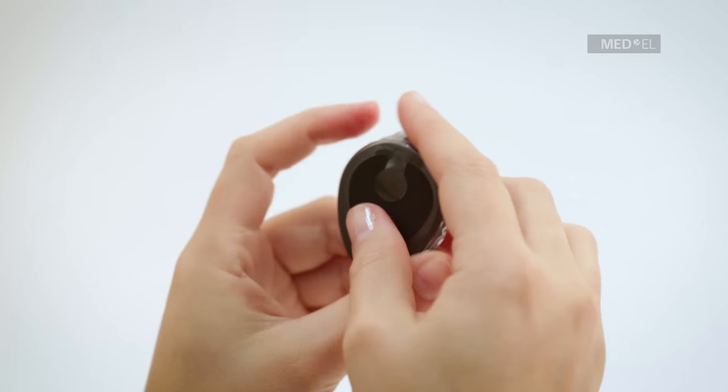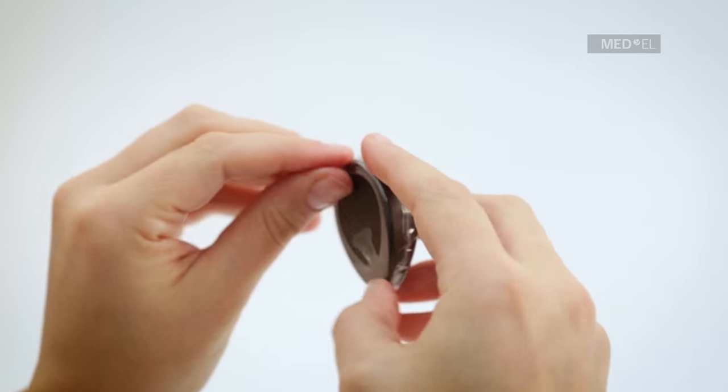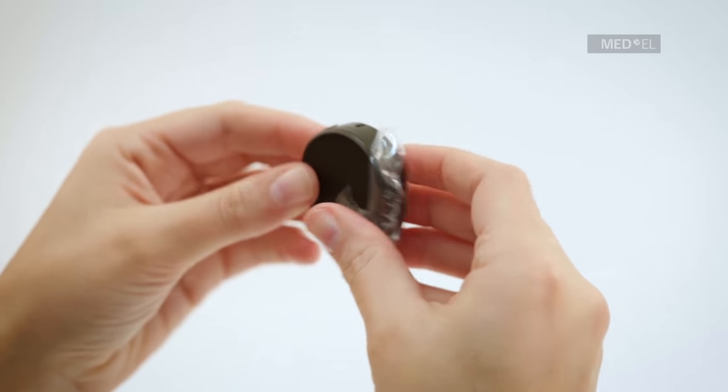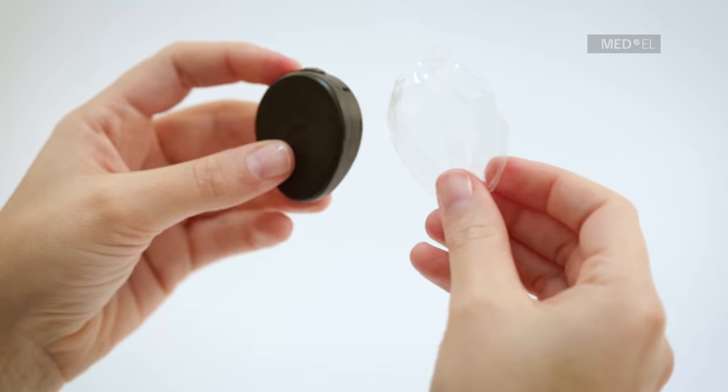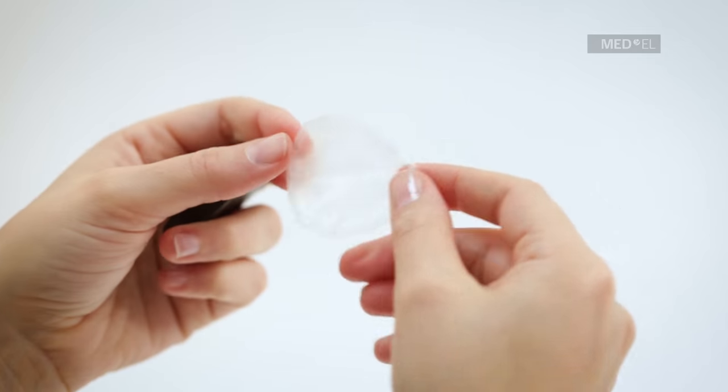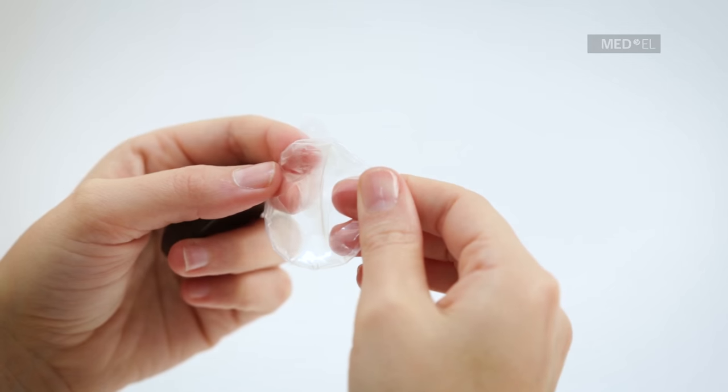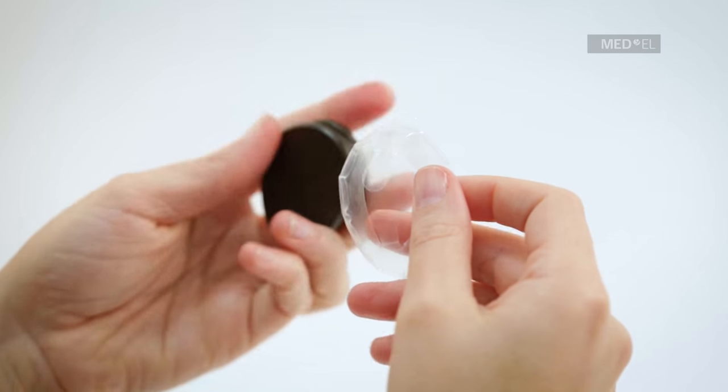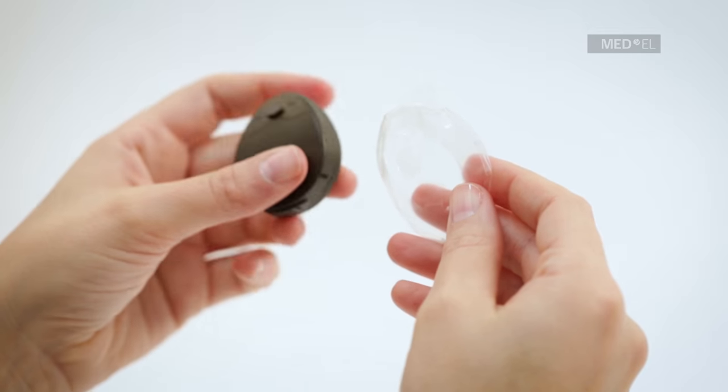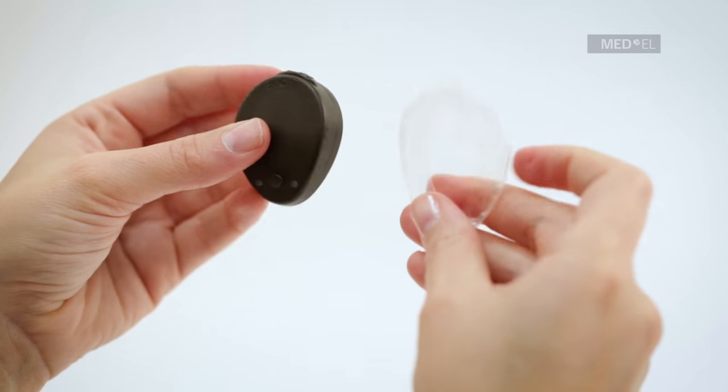Pull waterware gently off of Rondo and make sure that you do not damage waterware. Waterware can be used up to three times, but the adhesive strip needs to be replaced each time. Follow the previous instructions and ensure that there is a complete seal with the adhesive and waterware before reusing.